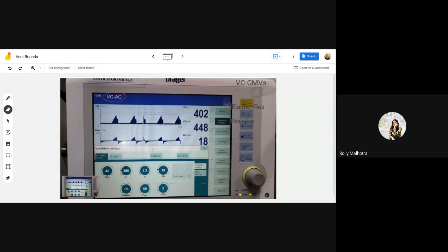Yes. So in this flow ACC, this means that it's the ramp, right? The acceleration with which the flow goes to achieve the time. If we are increasing from 65 to 110, suppose, that means we are increasing the speed, the flow, to reach the tidal volume faster. So is it the ramp?